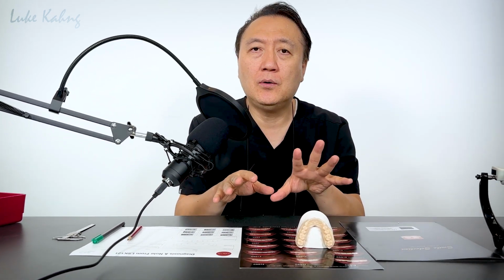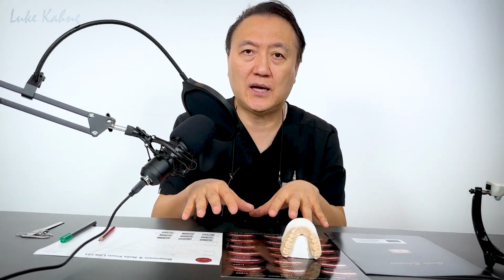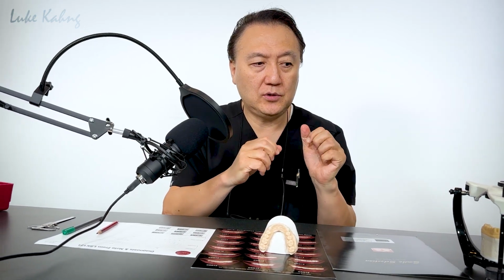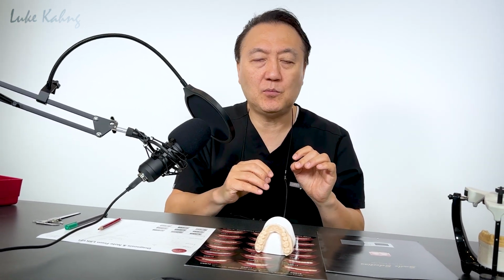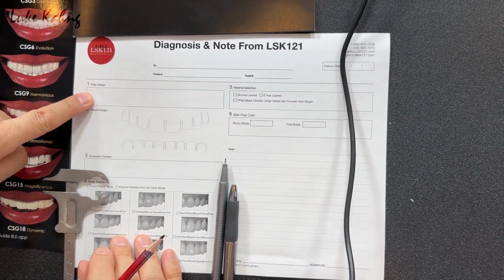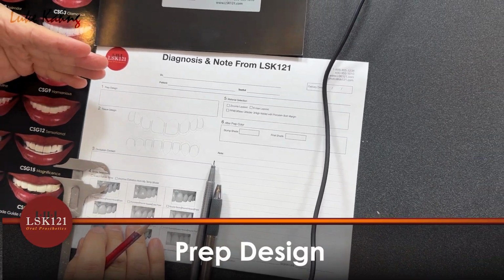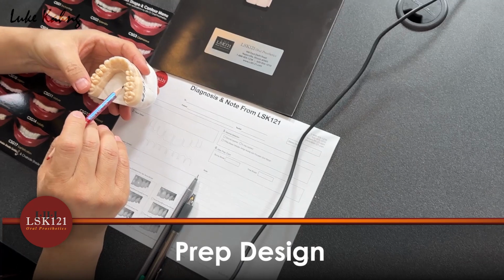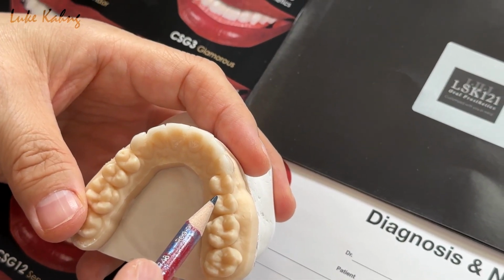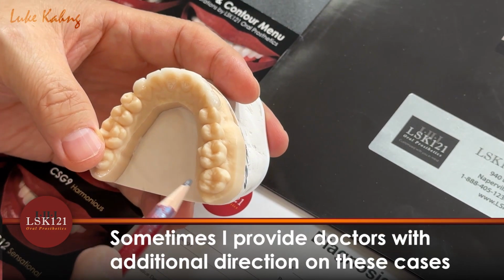In this video I'm trying to give you more information about what I do here, and you can get more information from me. Okay, so I have to give them the prep design, which the doctor provides us. Sometimes I see composite area markups from a dentist. I have to give them a little better direction compared to what they see.